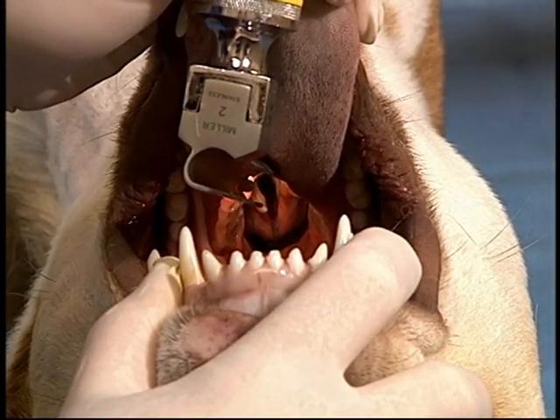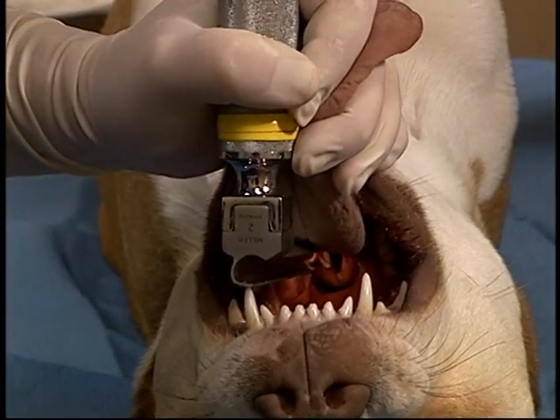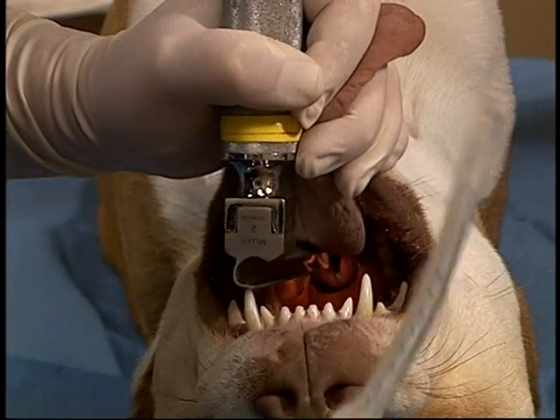Dorsal intubation can also be performed by a single individual. This allows the arytenoids to be easily visualized. The blade is placed over the epiglottis and braced on the hard palate or on the teeth.